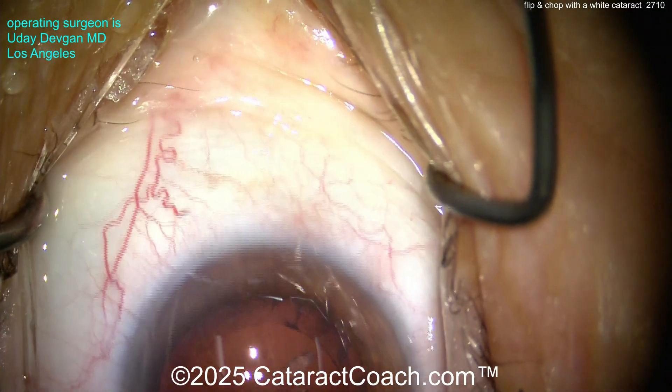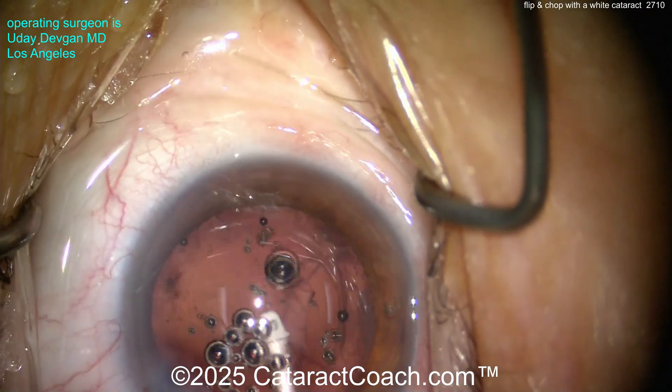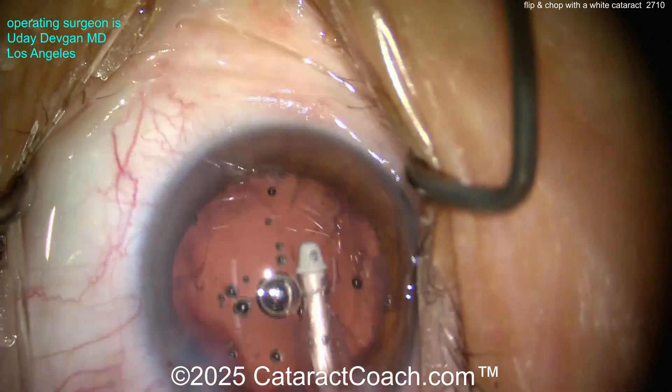Now we're going to do some cortex removal here. Let's take a look inside the eye — not a whole lot of cortex remaining. We'll clean that up pretty easily.